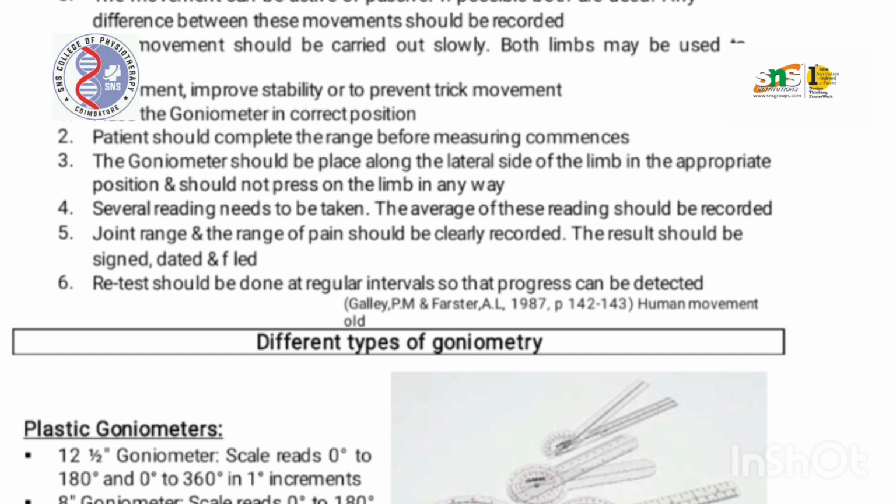The movement should be carried out slowly. Both limbs may be used to aid movement, improve stability, or avoid pain and trick movements.